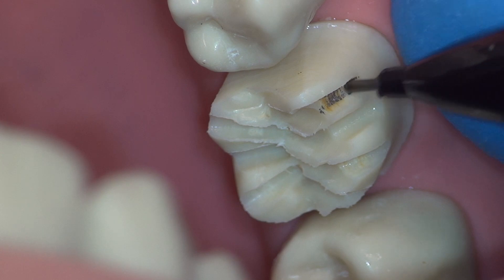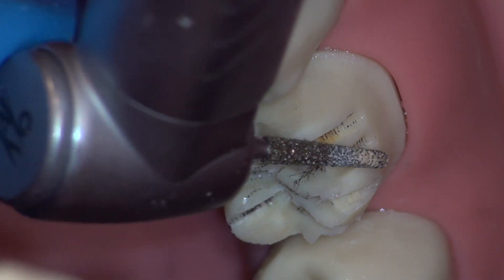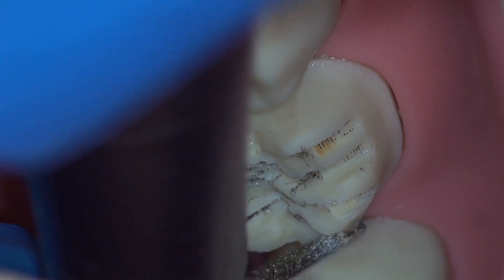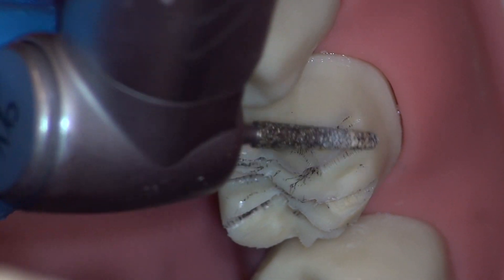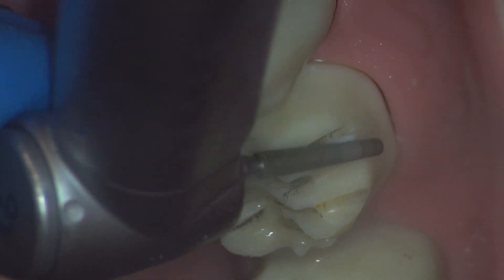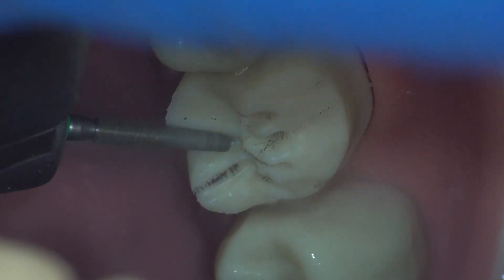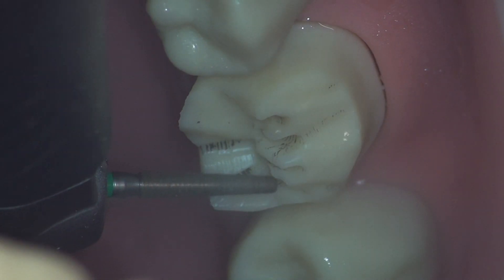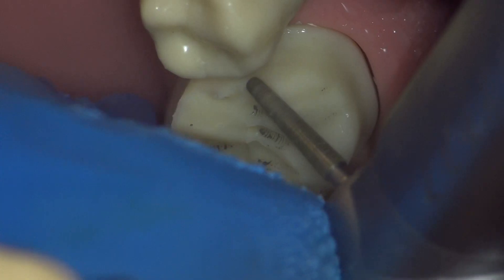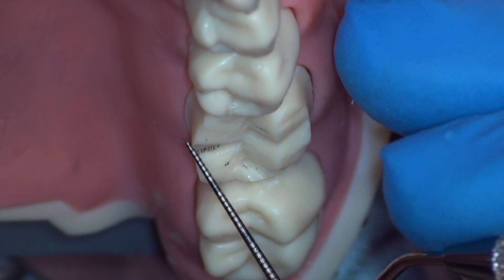The depth grooves are now completed. We use a mechanical pencil to mark the bottoms of the depth grooves. In this way we will see the pencil wear away as we reach the final depth. We can turn the burr on an oblique angle such that the tooth structure cages the burr so that it does not drop into the depth grooves. By turning the burr on an oblique angle it is impossible to change the depth of the grooves until we have reduced all of the tooth structure between the depth grooves. From here we simply reduce the struts of tooth structure between the depth grooves until we see the pencil lines start to wear away. Keep in mind which depth grooves signify peaks and which depth grooves signify valleys. During this step we are still cleaving large amounts of tooth structure, so the rotation direction of the burr should be against the direction that we're moving. Anticipate any areas that have not yet been prepared — these will need additional reduction.